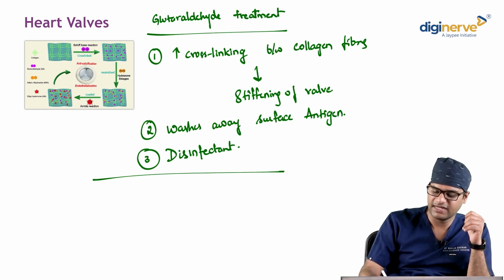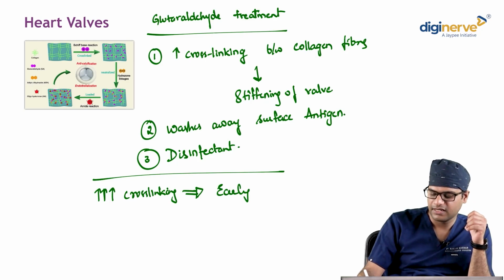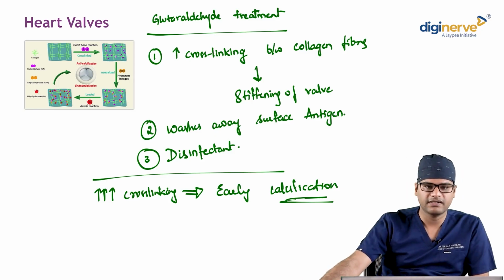The only disadvantage is that if there is induction of increased cross-linking, this leads to early calcification. That is one of the disadvantages of too much glutaraldehyde treatment.